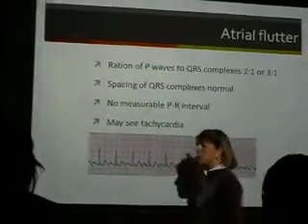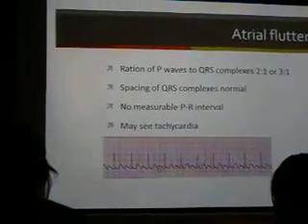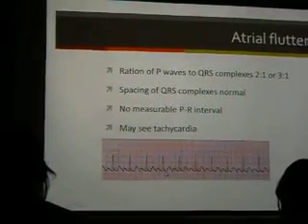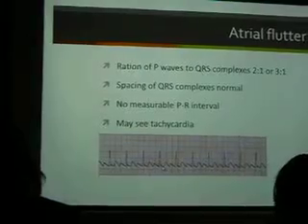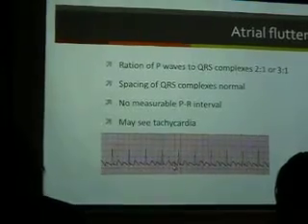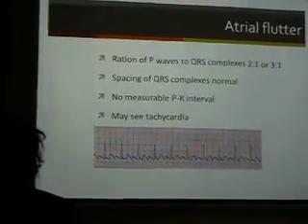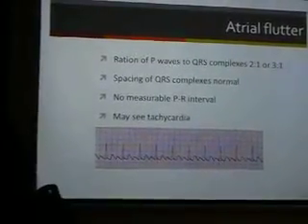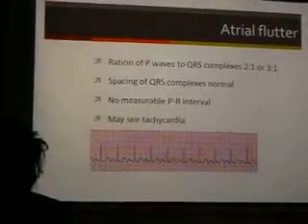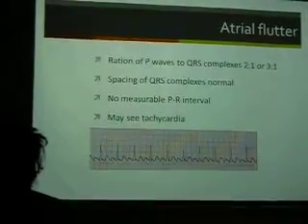Let me take a look at this. I may swap that one out for you. What about that little bump right after QRS? This one? This is P, but we should have more right after it. Like some of them have a little bump. I mean, it could be T, but I don't think so. I think we should have more obvious ones. Yours is different? Okay, let me look at yours. And it could be when I made the PowerPoint, I put the wrong one in. Yeah, yours is right. Mine is not. And so if you look there, you'll see P, QRS. The flutter's the same? Yeah, you're looking at the wrong one. All right, let me check that.